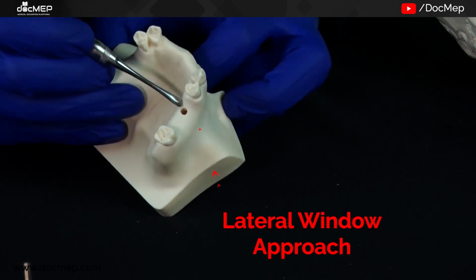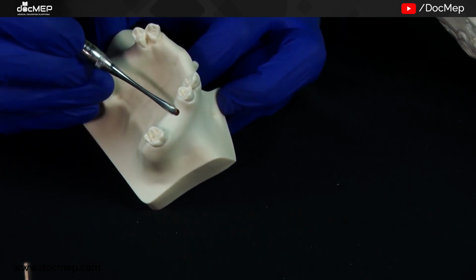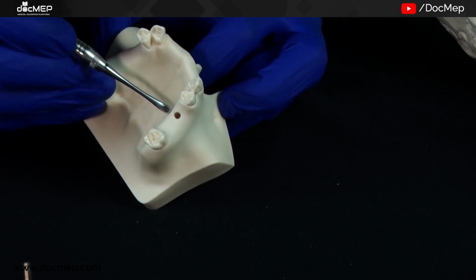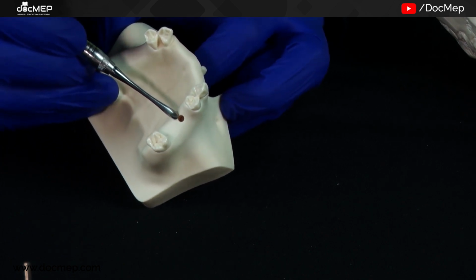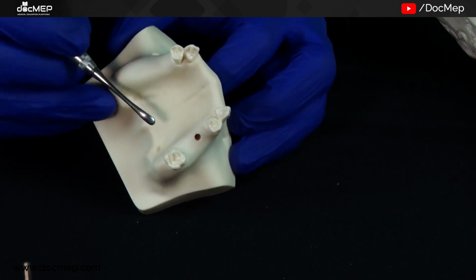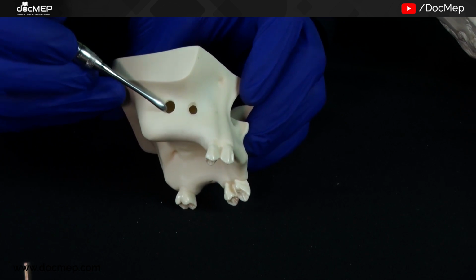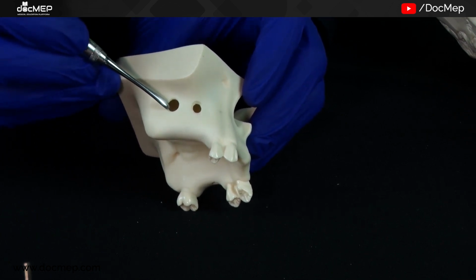So when you have 5 to 6 mm bone available, then you can go from the crest. You have specialized instruments. You can lift the sinus floor, put a graft from this side only, and can place the implant simultaneously. When bone is less than 3 mm, or 1 to 4 mm, that time the lateral window approach is better. So when you see the CT, you understand this.